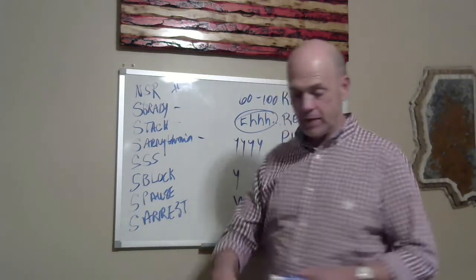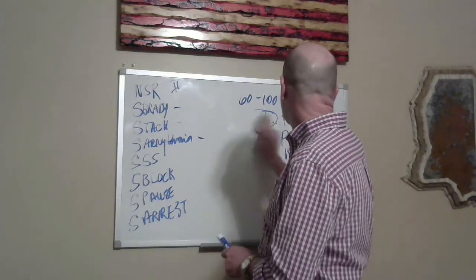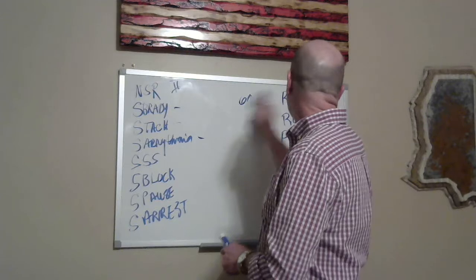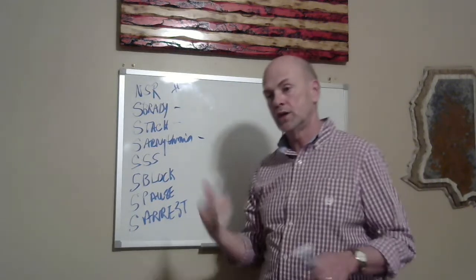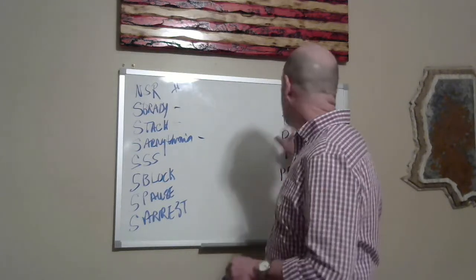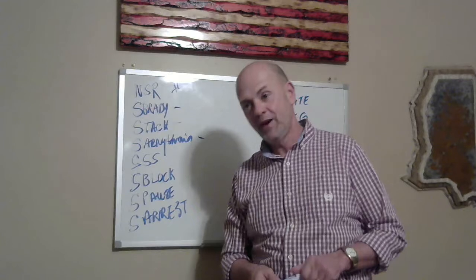So sinus arrhythmia, again, is not a correctable arrhythmia. And I don't think you're going to see it in the American Heart Association guidelines associated with sinus arrhythmia. When they said, is it regular, you would say, no, it's not regular.